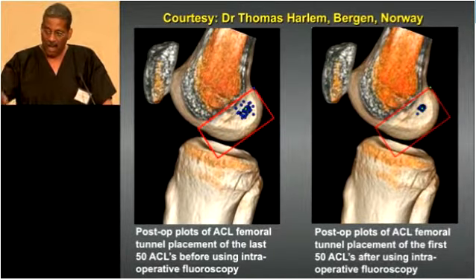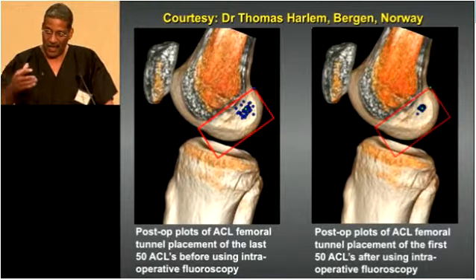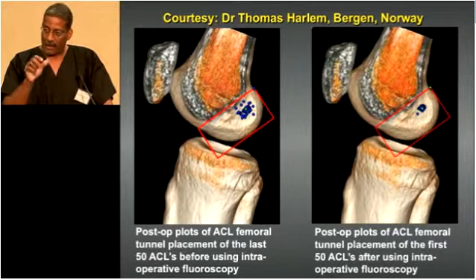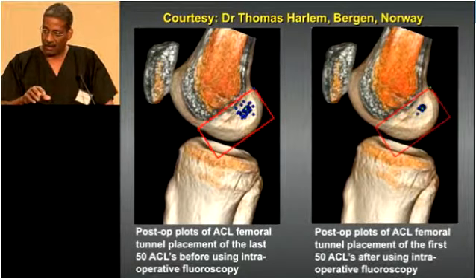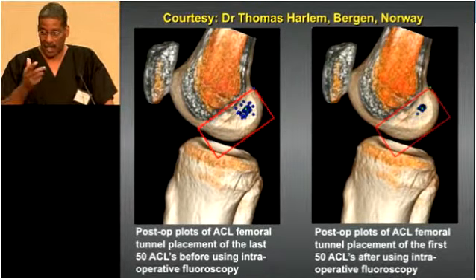So you pick the position, and I have one I like, but you have to decide where you want to be. Thomas is doing post-op studies, so in 2 years he's going to be able to correlate the final position with the clinical outcome. In 2 years, I think he'll be able to tell us which tunnel positions gave the best clinical result. That's the project we're working on. That's the ultimate goal, which one gives you the best outcome, so hopefully in 2 years we'll have some data on that.